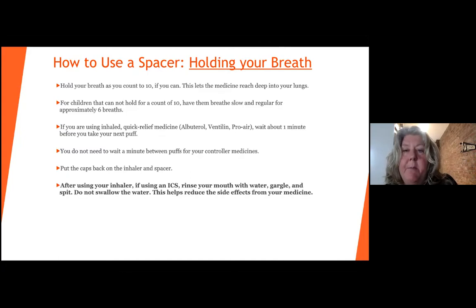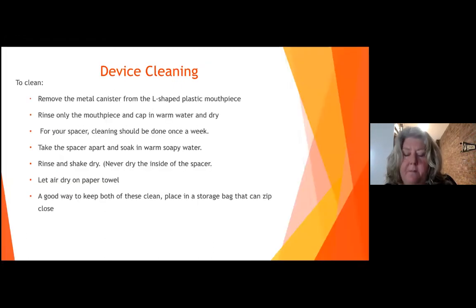Okay, that's it. You took your breath. You're going to put the cap back on both your inhaler and your spacer. And if it is a daily controller medicine, remember, we talked about rinsing your mouth or washing your face. All right. I'm going to do a quick demonstration for you.